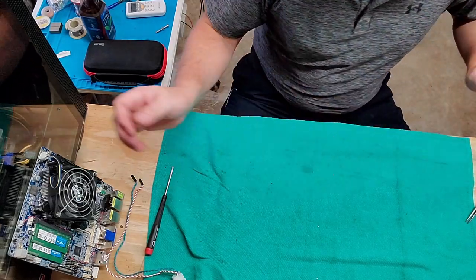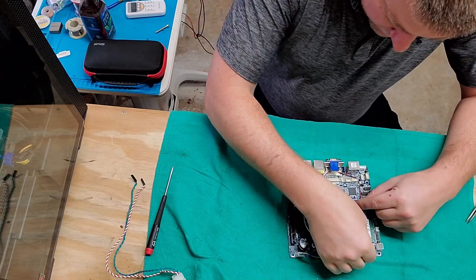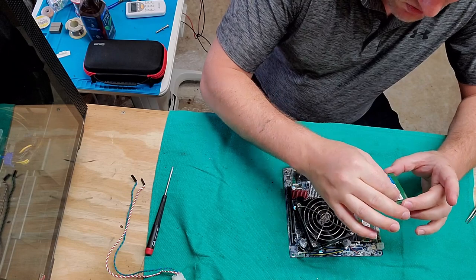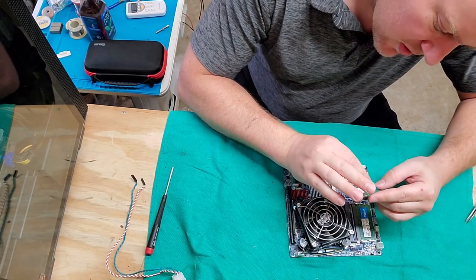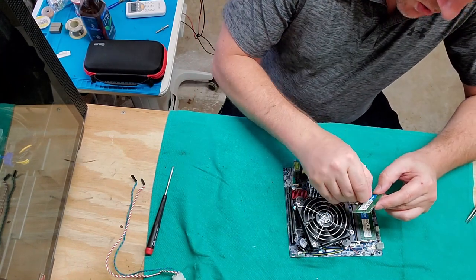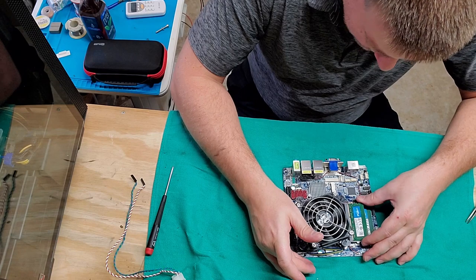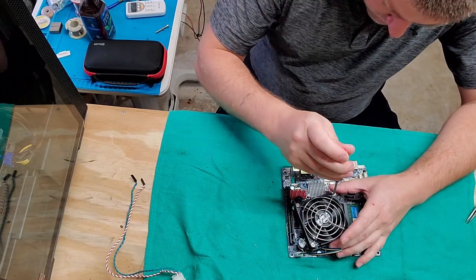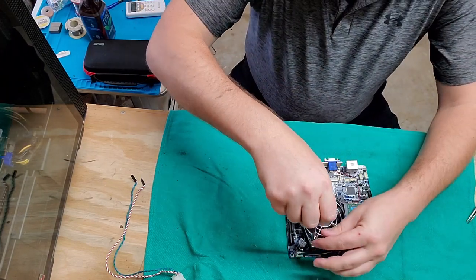I imagine that this is a very expensive PC, guys. So we have two memory modules and they are caked with some dust, of course. Why wouldn't they be? Okay, so they're DDR3 2GB modules. So this CPU is probably about a decade old. That's already kind of dating itself just from the look of that. It's a neat little motherboard.